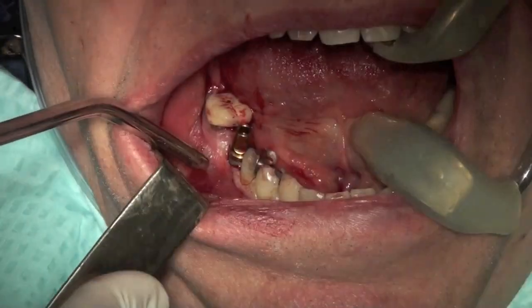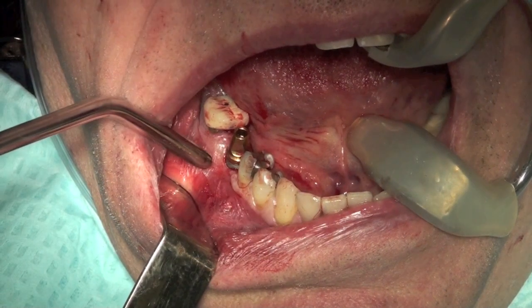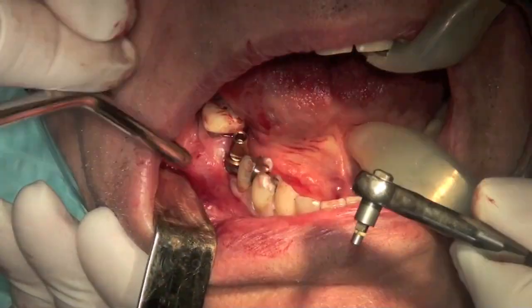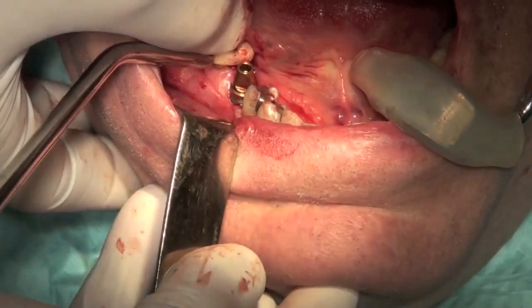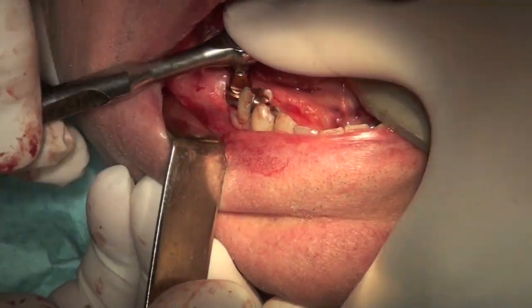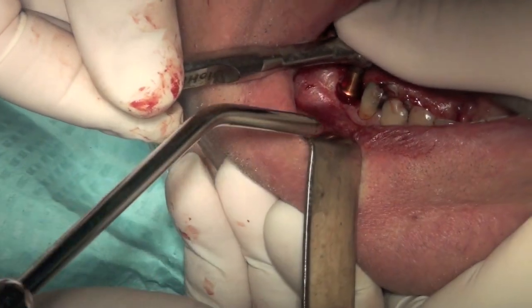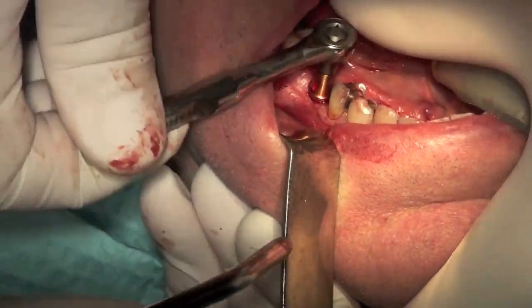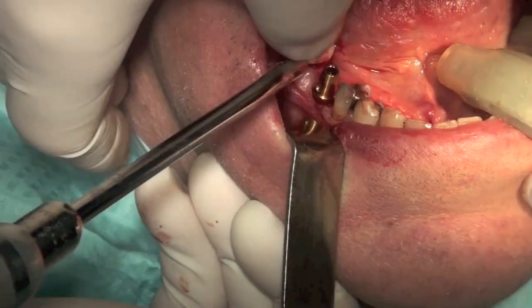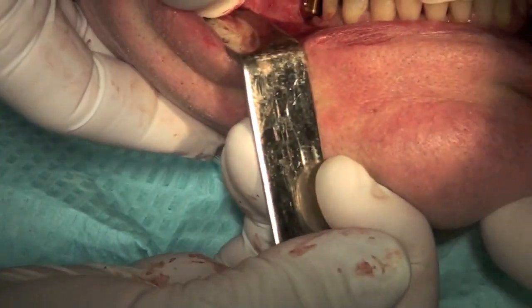You want to go more than that. Let's see how little... not yet. See that? Yep. Still? No. Yes sir. No. Let me check the alignment. Close. Out of view. Out of view. Now go in deeper.